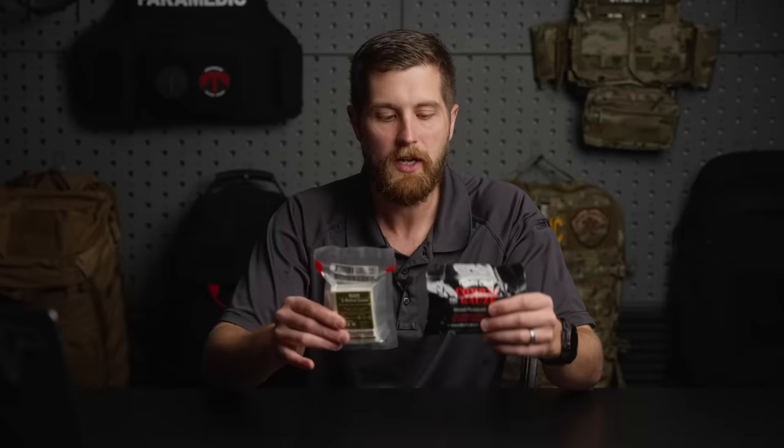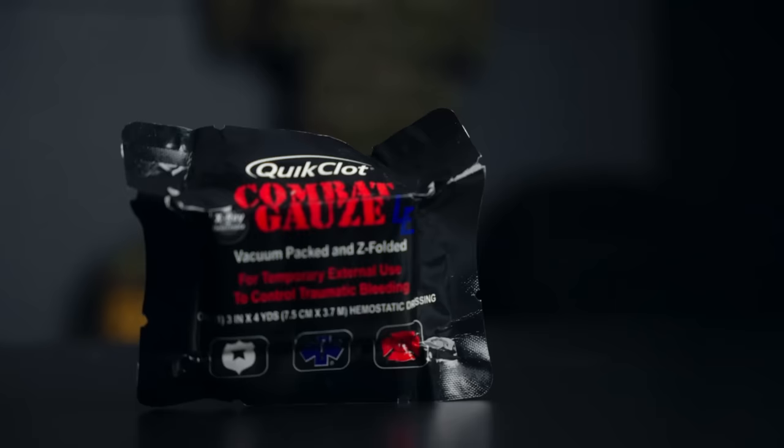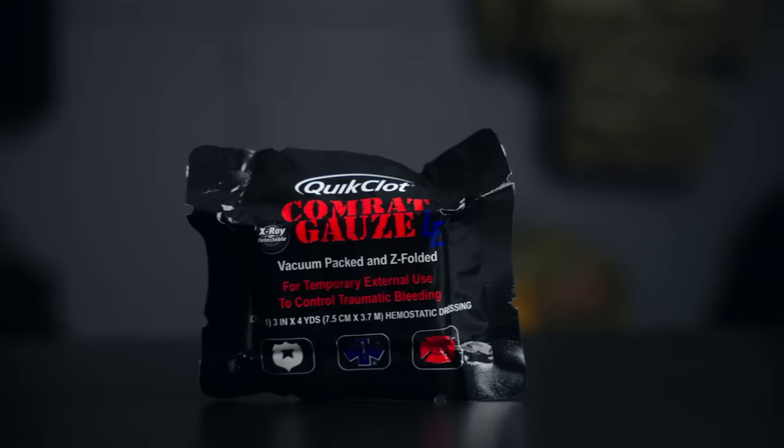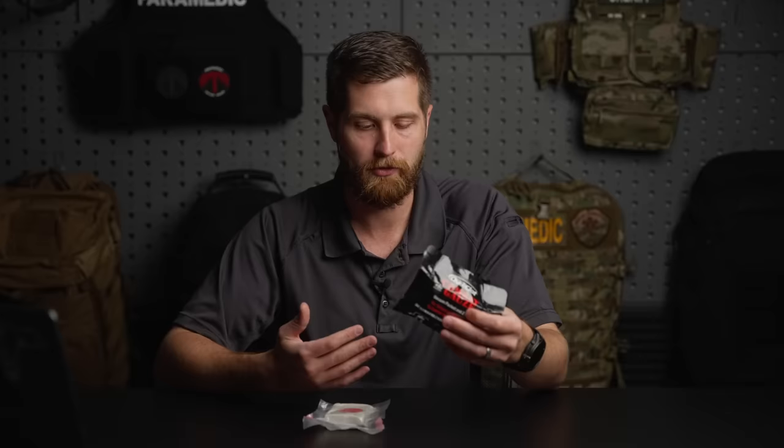For the purpose of this video, we're going to pack the QuickClot. Just a quick review — this is to pack junctional sites: the base of the neck, armpit, and groin. But also, if you don't have a commercial tourniquet immediately available, this can be used to pack any wound on the extremity regardless of its location. So it's a very good piece of equipment to have for your life threats.